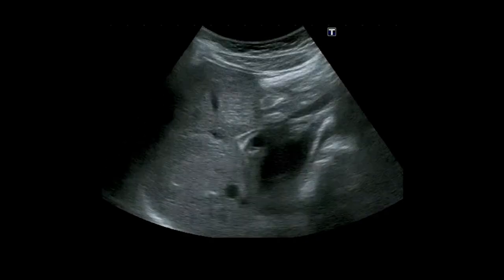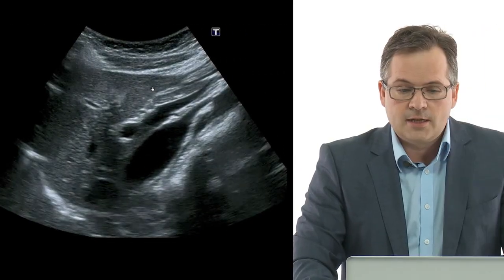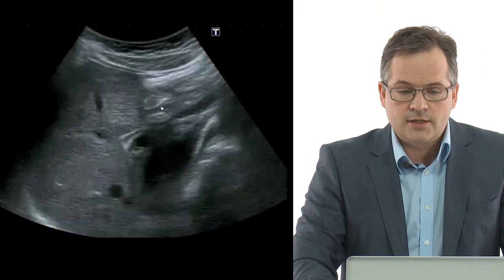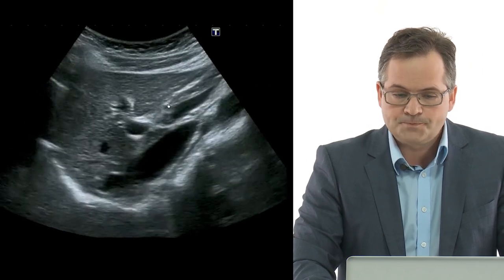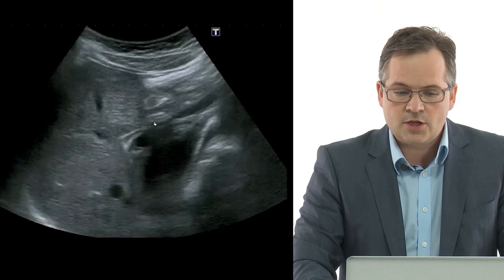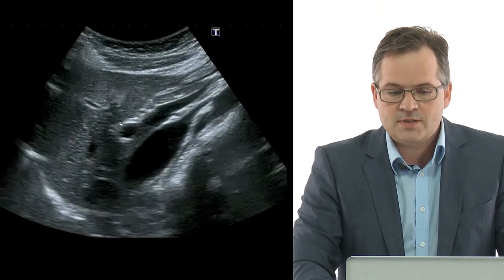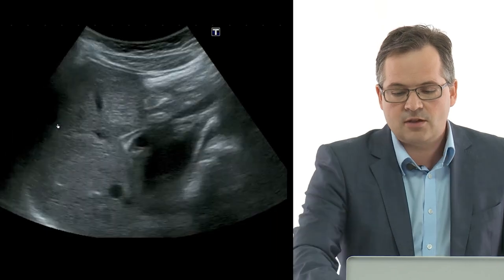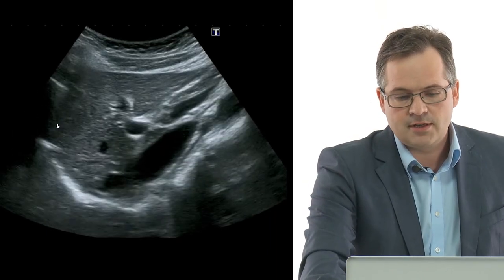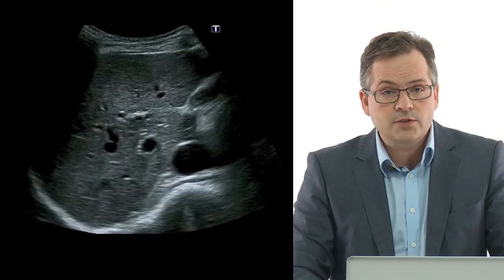In the next scene, we try to find the gallbladder. We are scanning in the longitudinal and in the oblique subcostal view. We see the center of the liver. The jumping deer can be seen over here. But there is not really the gallbladder seen very clearly here. Now we try in the longitudinal view.